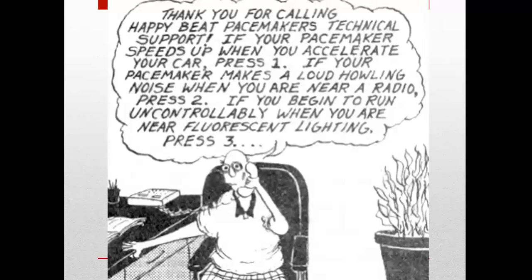So when a pacemaker battery starts to fail, the patient can notice a couple of different things. They can notice inappropriate slowing of the pacemaker rate or inappropriate tachycardia.